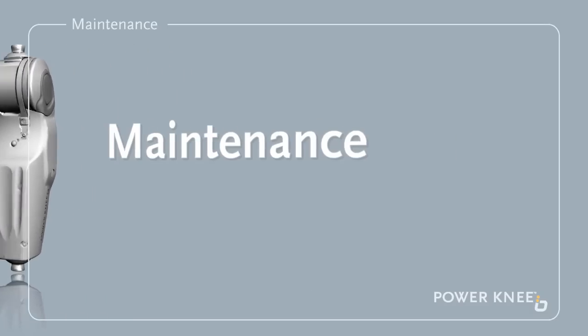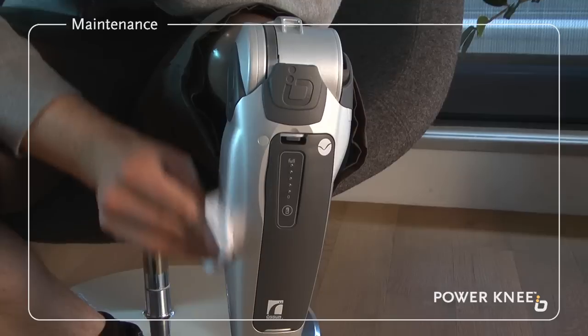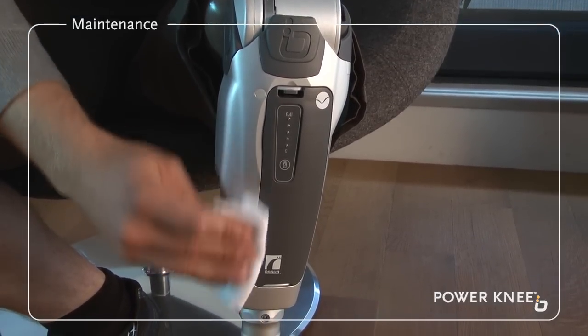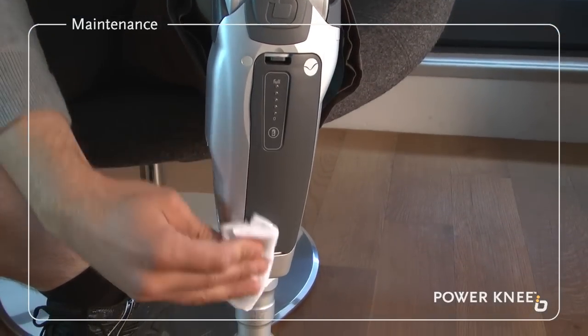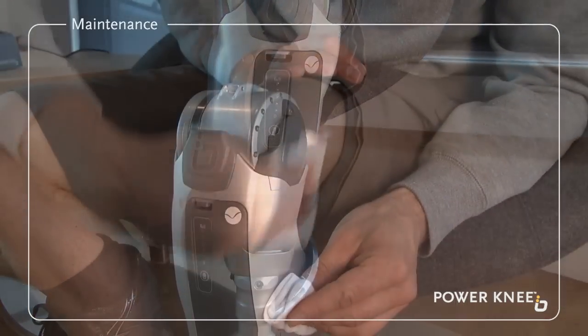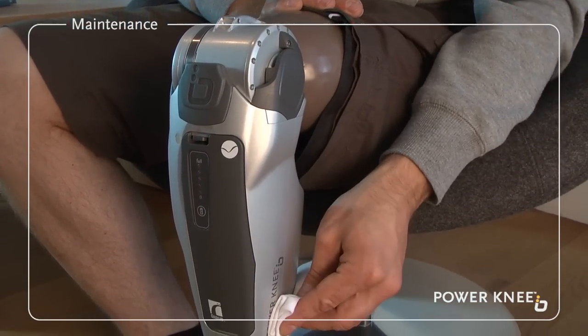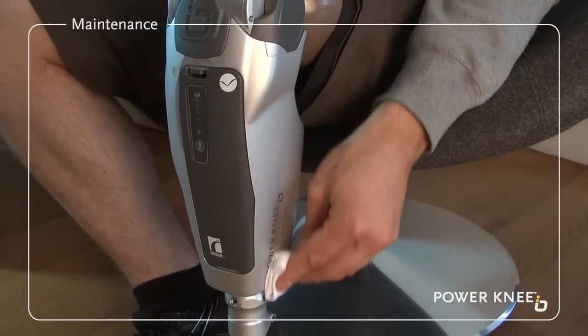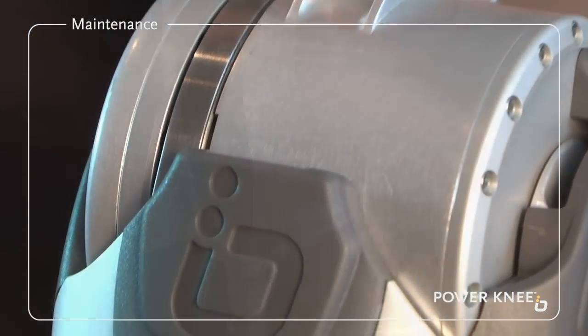Maintenance. When cleaning your Power Knee, please use a damp cloth and mild soap or isopropyl alcohol. Never use any solvent stronger than isopropyl alcohol and never use compressed air to clean the knee, as you may cause it to malfunction and deteriorate.